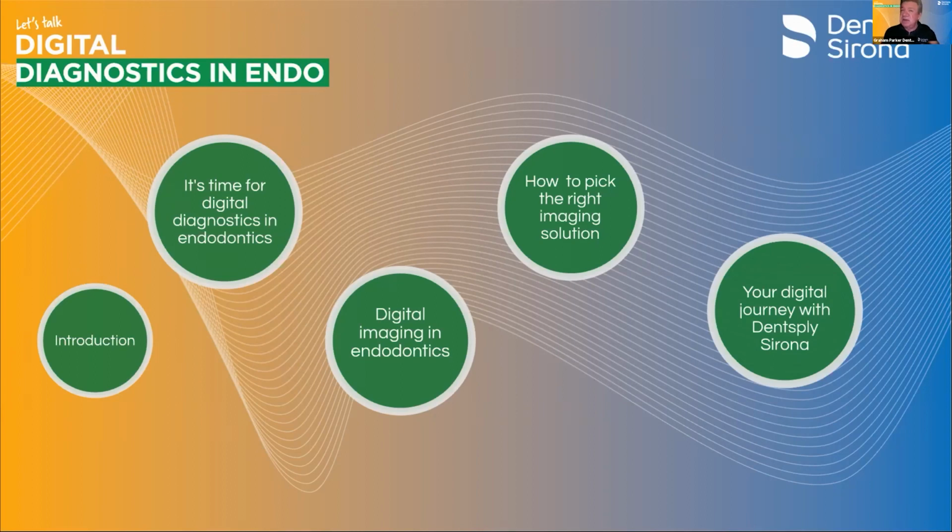It's not all about the resolution. It's more about the whole process: the machine, the sensors, the quality of the machine, the quality of your positioning of the patient, the quality of the screens you use. It's a whole imaging chain that you need to be aware of. So it's not all about the voxel size or the resolution.